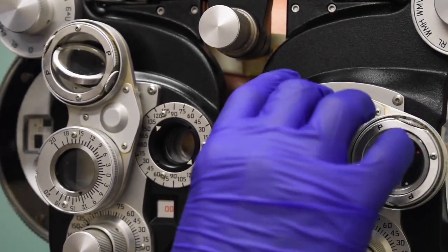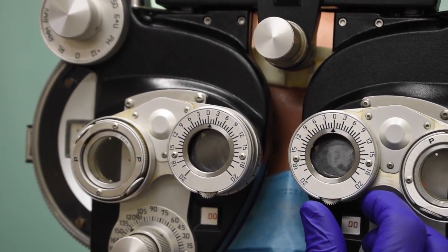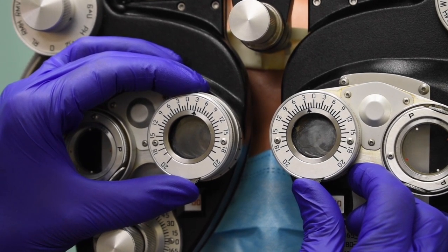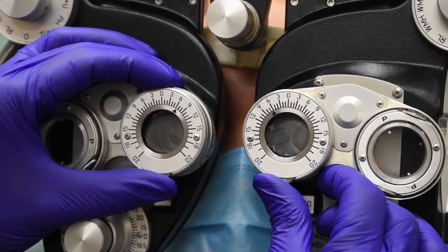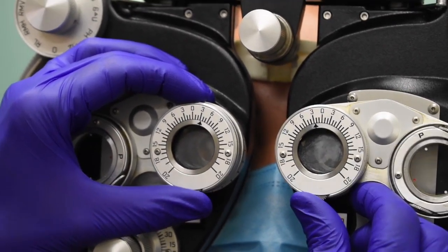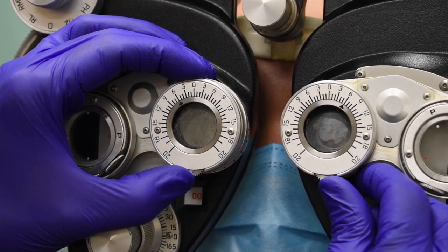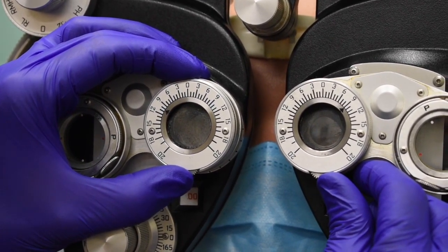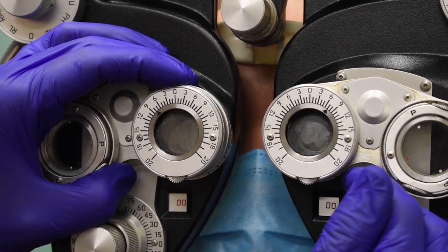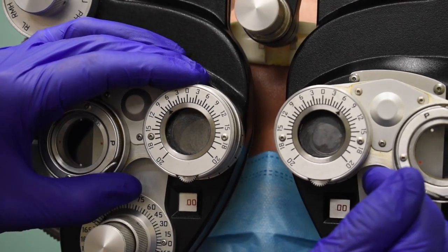So I'm going to have you close your eyes again, Phoebs. Now we're going to go ahead and do our horizontal vergences. Go ahead and open your eyes. Do you see just 1? Yes. I want you to tell me when you see 2, when you see that letter T either go blurry or split into 2. Two. And when you see 1 again. One. So 10/6 of base in. And tell me when you see 2 again. Two. And when you see 1 again. One. And then 18/15 base out.